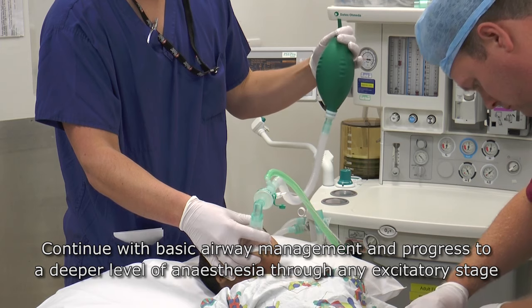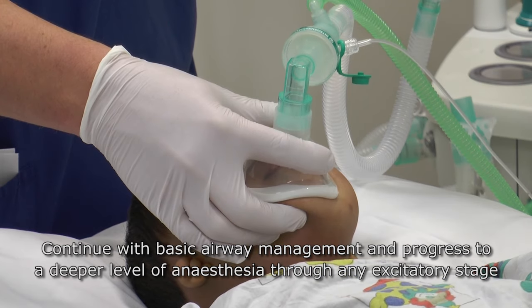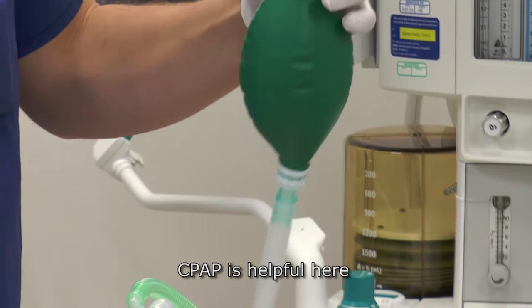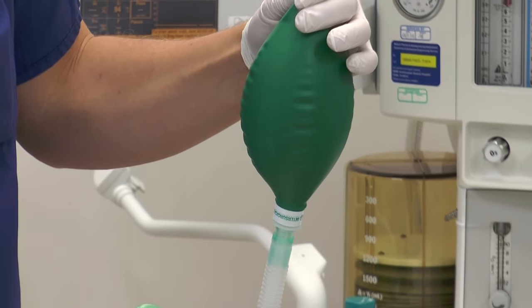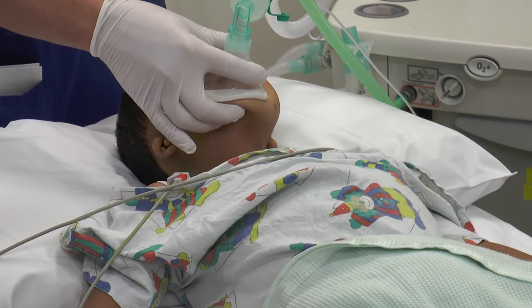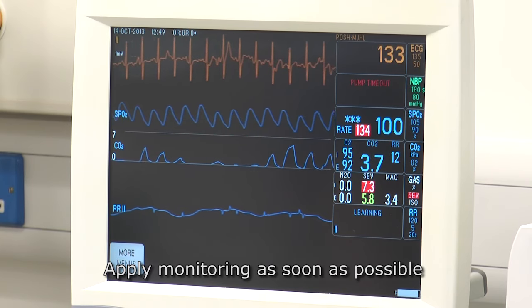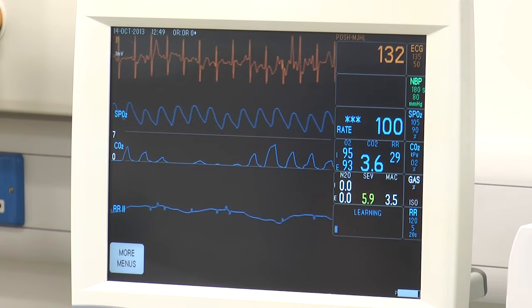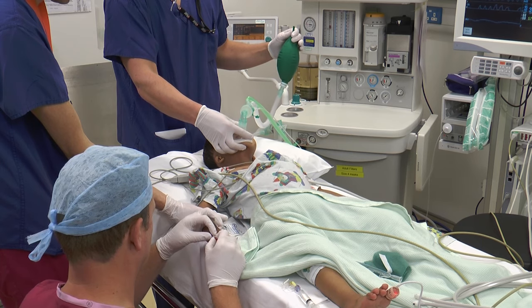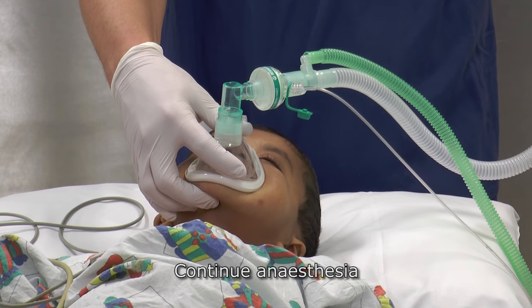Continue with basic airway management and progress to a deeper level of anaesthesia through any excitatory stage. CPAP is always helpful here. Always closely watch the patient and movement of the bag. Apply monitoring as soon as possible. Gain intravenous access. Continue anaesthesia.